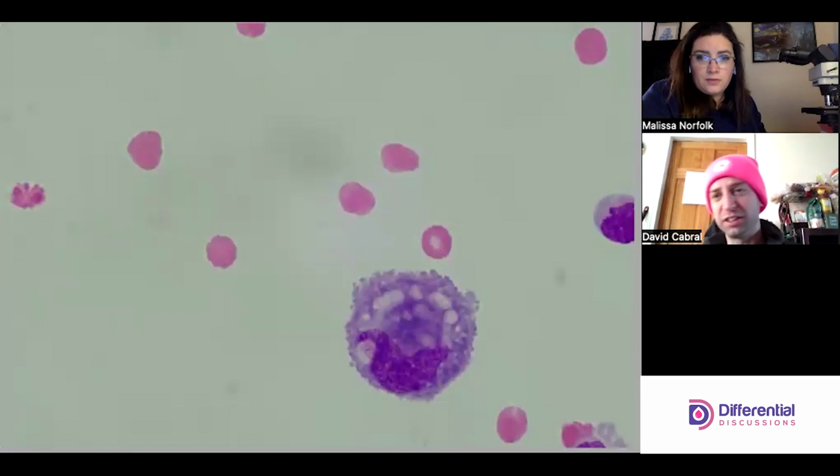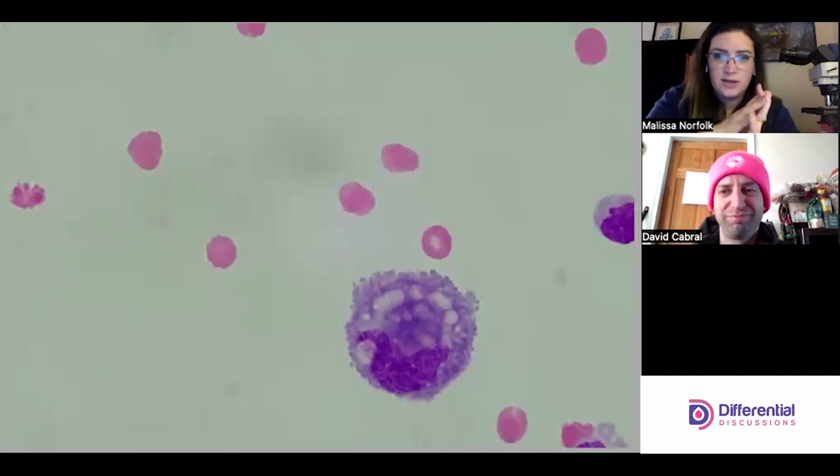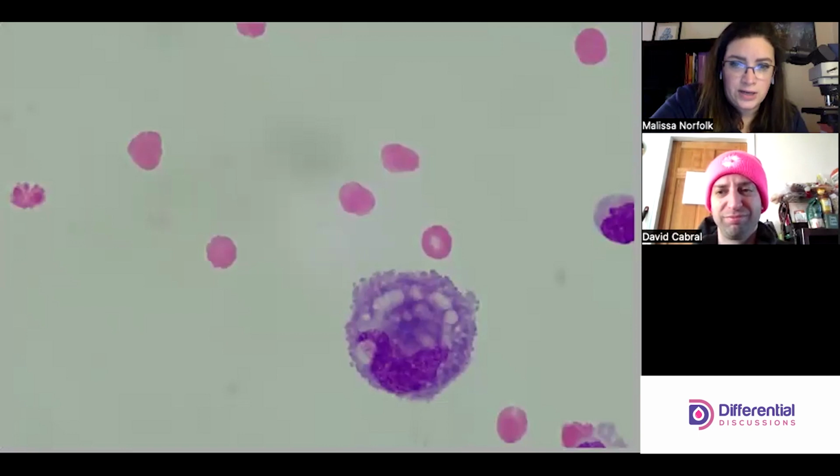You get these reactive histiocytes, right? Where normally our monocyte macrophages have little coloration to the cytoplasm, but sometimes they can be very reactive and get this basophilia. It's a tricky call. The nucleus being bendy like that lends to macrophage, but the coloration lends it more to the mesos that we've seen. And I was debating about the cytoplasm. I think it's almost looking more frayed than blebby at the edges of the cytoplasm.